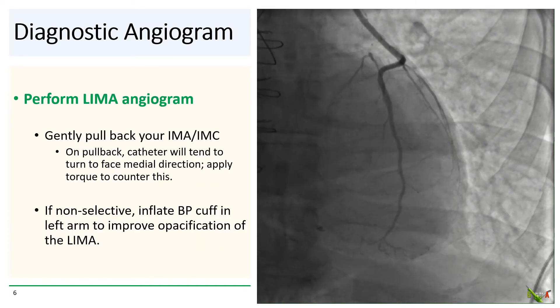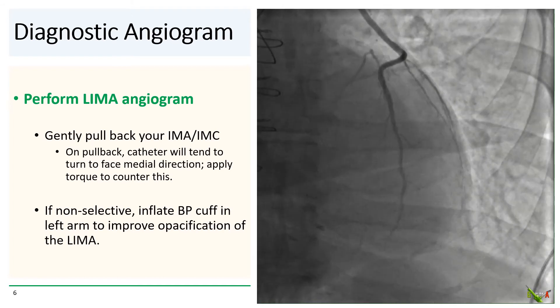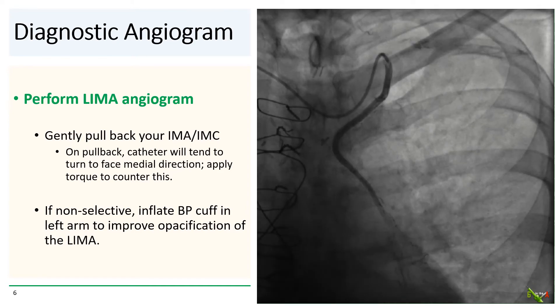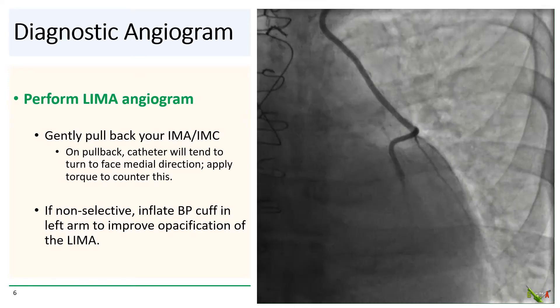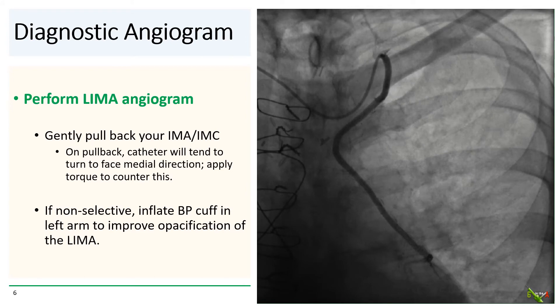Once you have your IM catheter into the subclavian, you then gently pull back the catheter as you normally would to engage the LIMA. I find that because of the right radial origin, the IM catheter will sometimes tend to want to rotate medially upon pullback, so you may have to apply gentle torque to counteract this effect. If despite your best efforts you are still not able to selectively engage the LIMA, inflating the blood pressure cuff in the left arm can improve opacification of the LIMA in a non-selective engagement. In our case, we engaged the LIMA with an IMA catheter and found that it was widely patent.